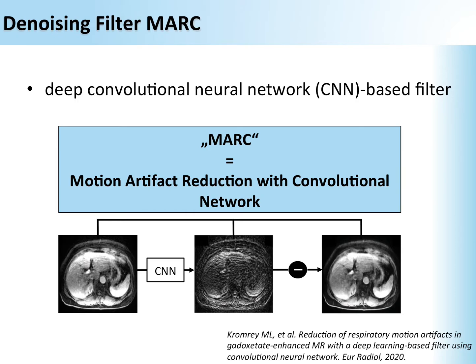Deep learning is based on neural networks with a high number of hidden layers. Here we also have the feed-forward technique of the convolutional neural network, or CNN, which has greatly improved the performance on various vision tasks, also in medical imaging practices such as denoising, segmentation, and super resolution. CNN employs trainable filters and convolution operations between the input and output, so therefore it reduces the amount of parameters necessary to be learned compared to classic multi-layer perceptron methods.